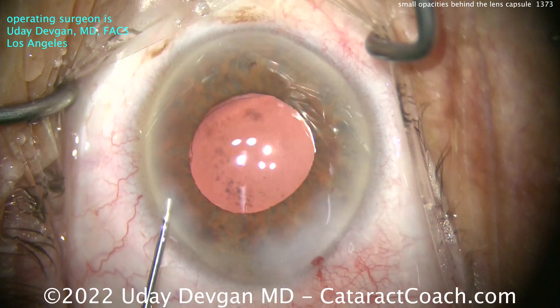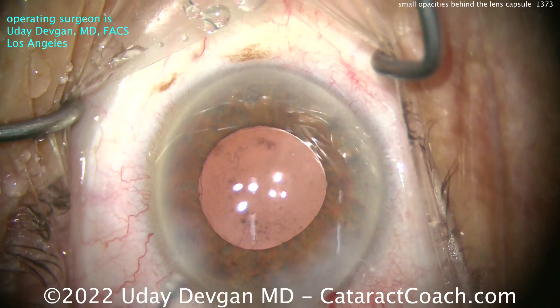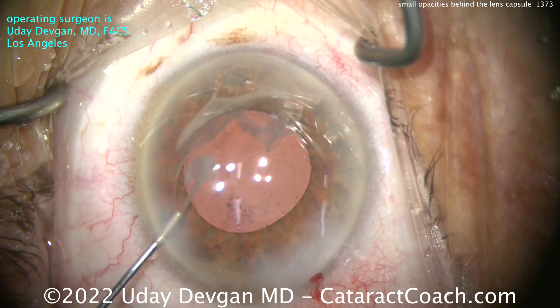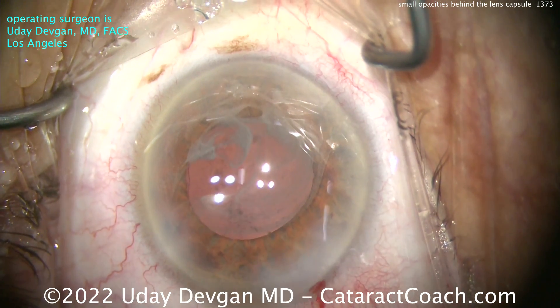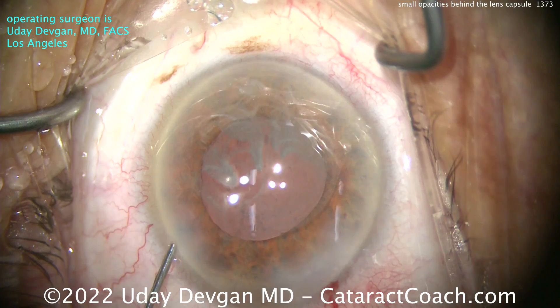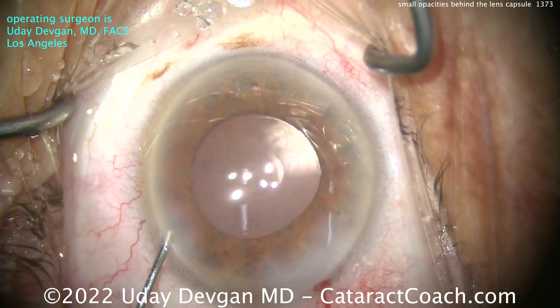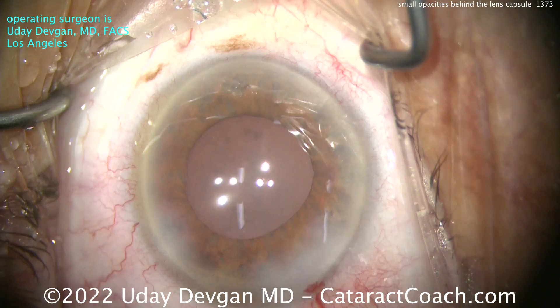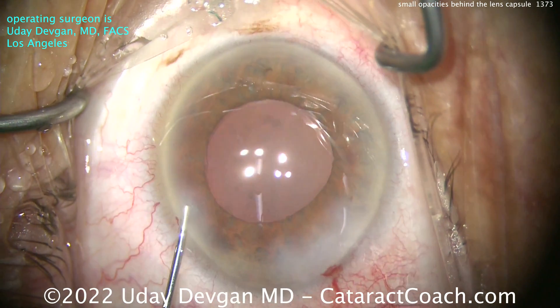Instead, we'll just put a little bit of triamcinolone in the AC here, and this patient will have a nice, normal post-operative course. So next time you see this, now you'll know exactly what it is — those are little tiny bits of lens fragment in the anterior hyaloid space, just behind the back surface of the posterior capsule.